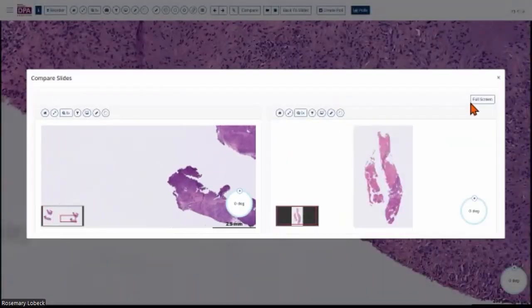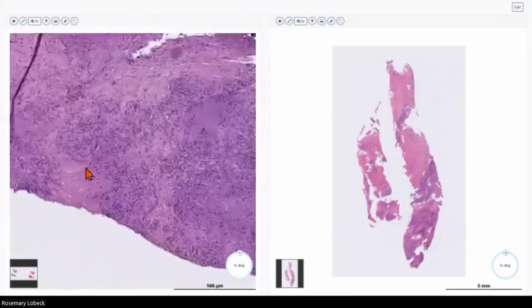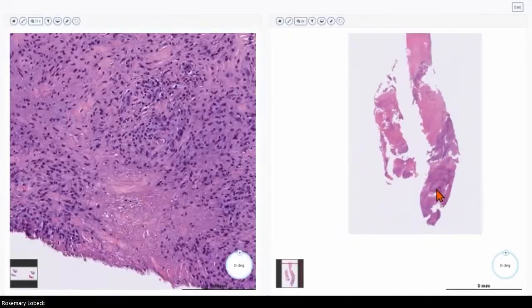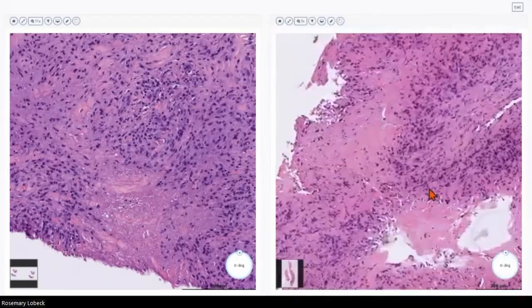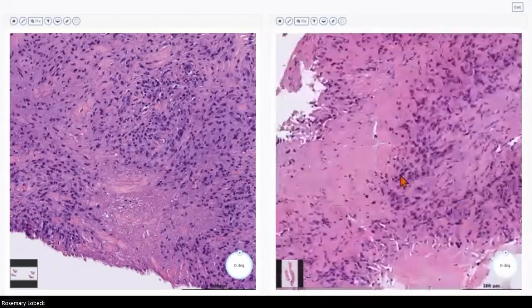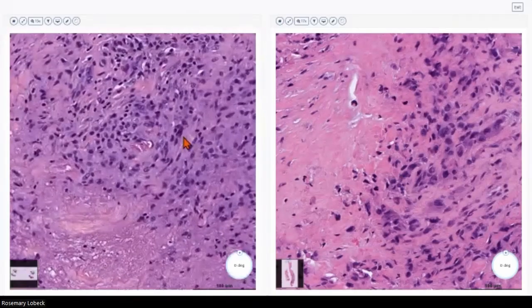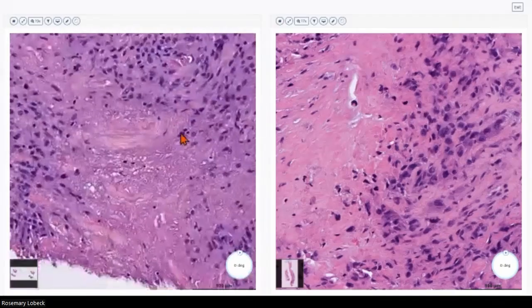So let's zoom in on the granuloma annulare. So that's where we are at, right? So let's zoom in anywhere on the epithelioid sarcoma. So, similar magnification, even higher here. So you could say that the granuloma annulare probably has more atypia than the epithelioid sarcoma, right? So this is a huge pitfall, and we need to recognize it.